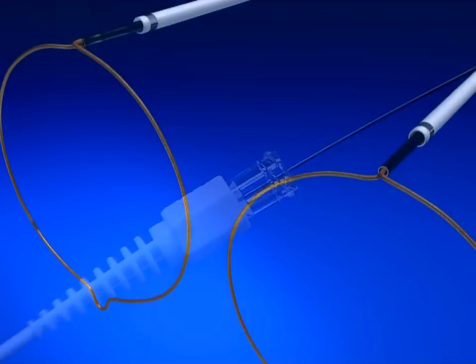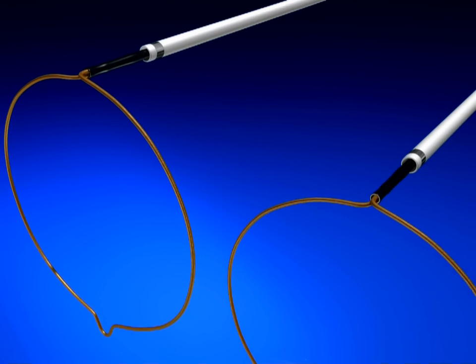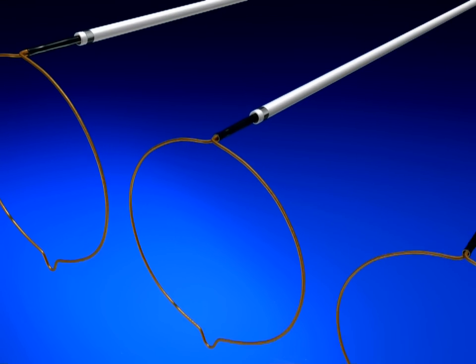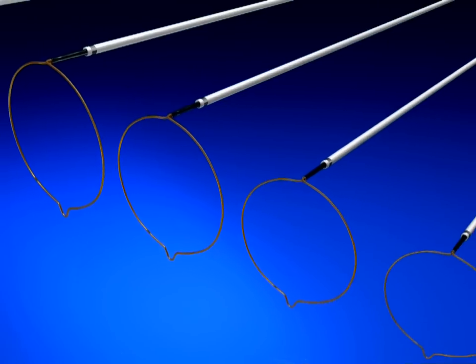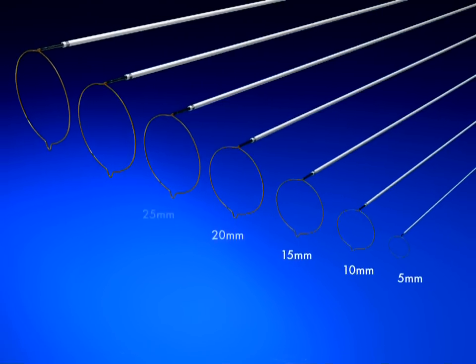To accommodate a broad range of vessel sizes, the One Snare Endovascular Snare System is available in nine different kit configurations with seven snare loop sizes ranging from five millimeters to thirty-five millimeters.